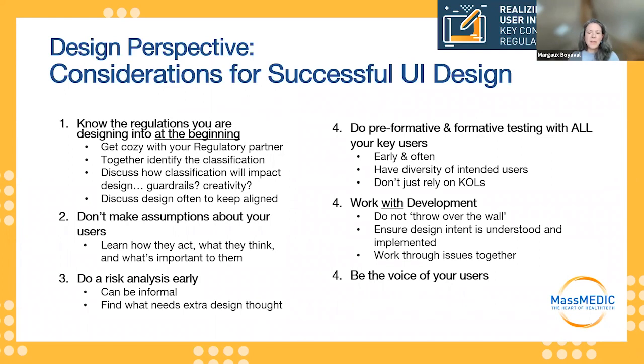Secondly is really don't make assumptions about your users. So a lot of times the design process will start with, okay, what is the goal for the organization or the business? We think that our users or patients or clinicians act like this and want these things.